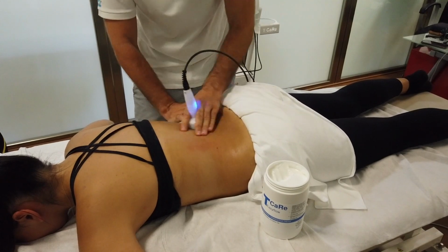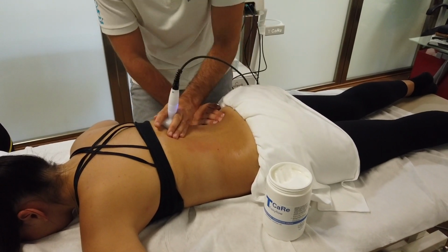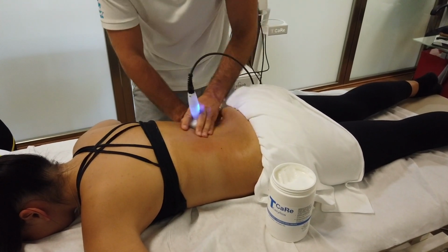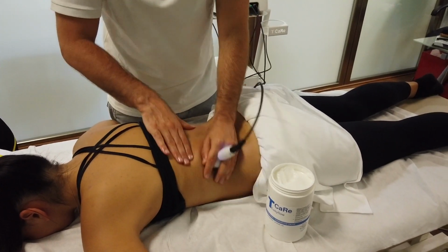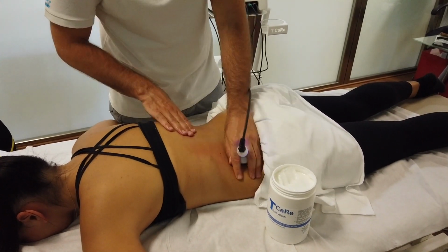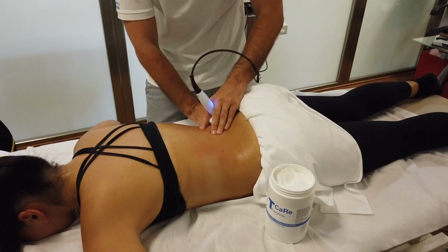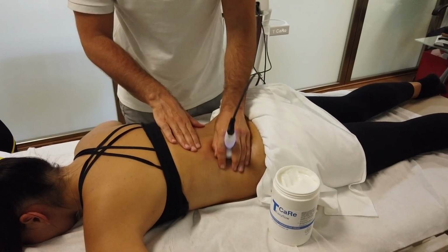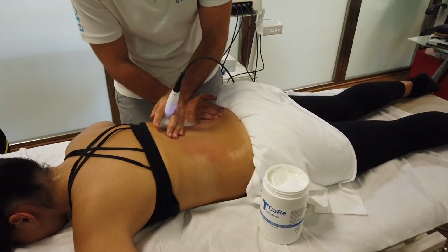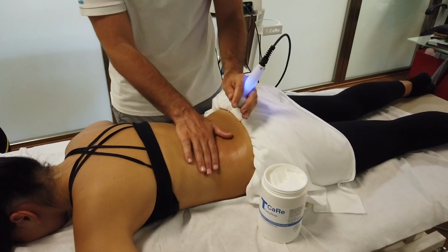And I have to use this type of handpiece, this type of electrode, faster than the other electrodes, because in this modality I avoid burning the tissues of the patient. As you can see, I have an increase of the temperature, because you can see the skin is red from the increase of the vascularization of the skin. The thermal sensation is about 3, maximum 4 out of 5. It's important with this type of electrode to start and stop the application of the electrode quickly.